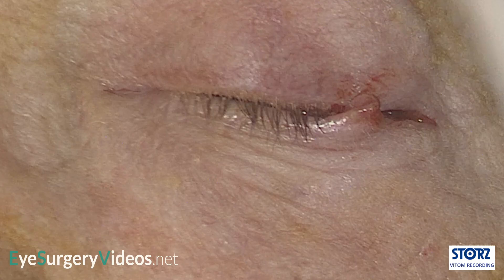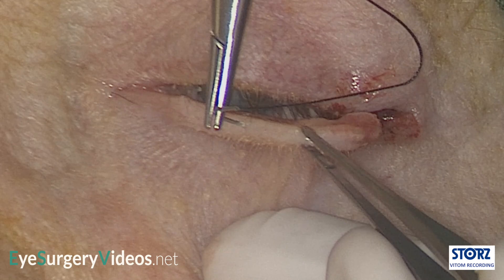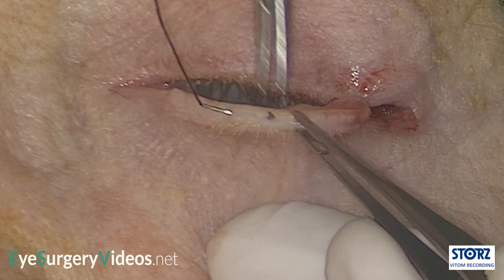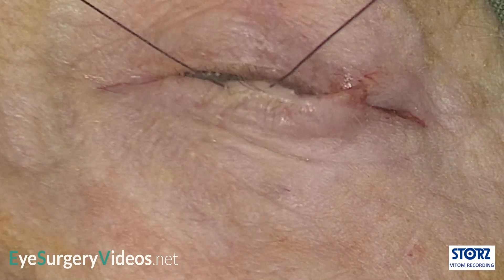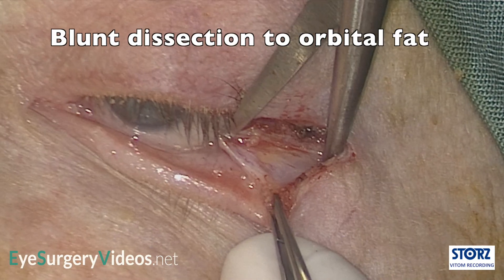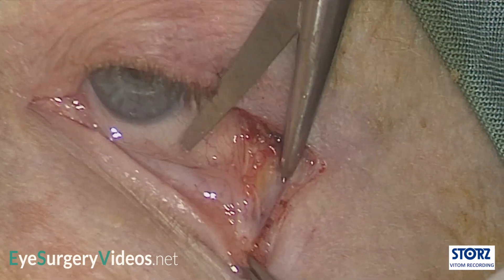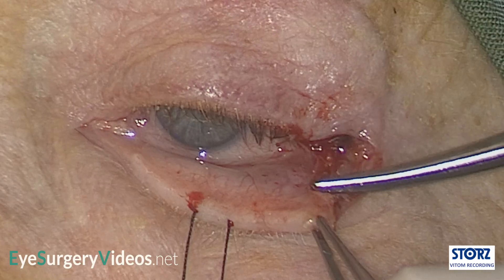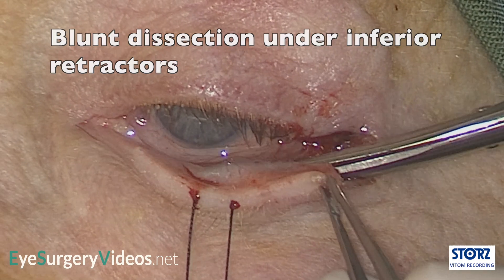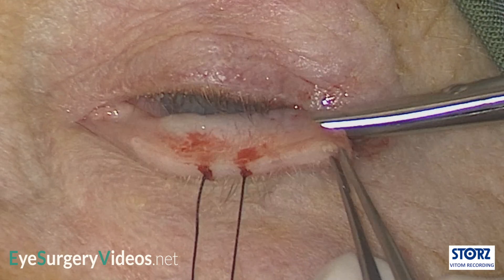The inferior limb of the lateral canthal tendon is transected and the eyelid can be easily and markedly distracted away from the globe. A 4-0 silk traction suture is placed through the grey line of the lower eyelid. Straight, sharp scissors are spread just inferior to the tendon to create a small prolapse of orbital fat. The scissors are then passed into this pocket and medially along the plane immediately posterior to the retractors.